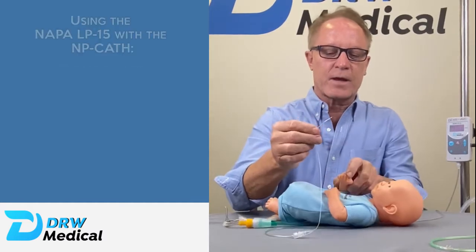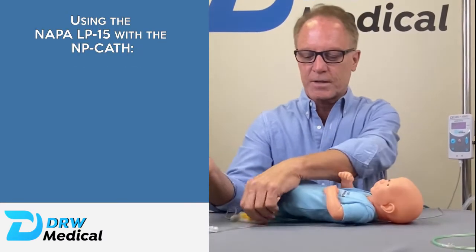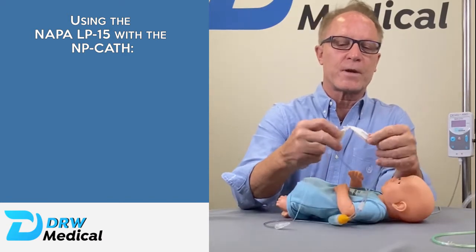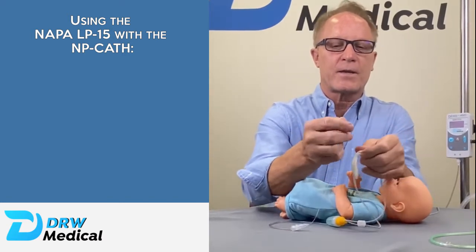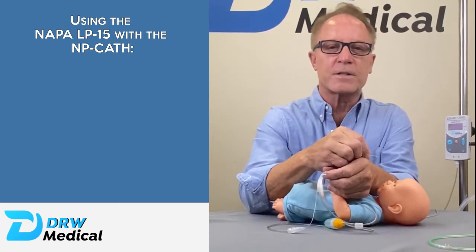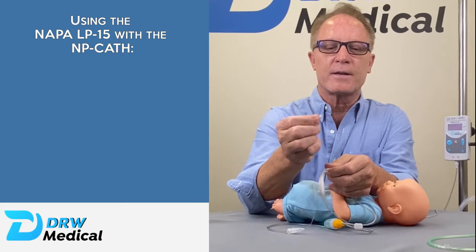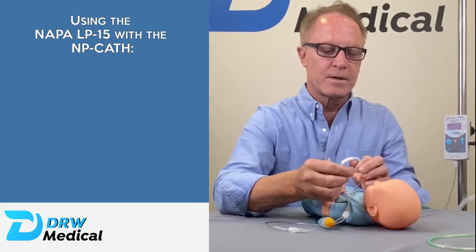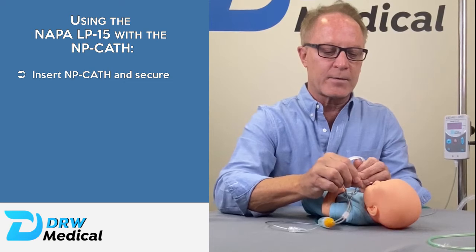We're going to quickly show you how to do this. We're going to be using the OptiFlow Junior from Fisher & Paykel. The NP catheter itself just sits just inside the nares, just far enough inside to capture the pressure created by the OptiFlow Junior. So we're just going to insert that one centimeter into the nares.